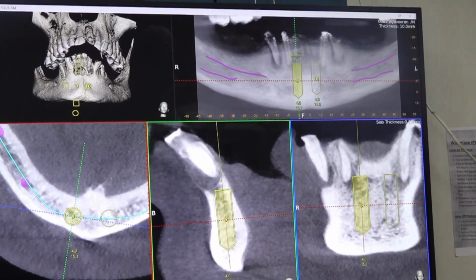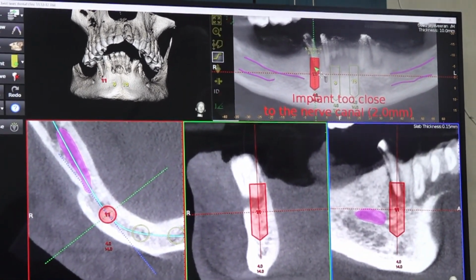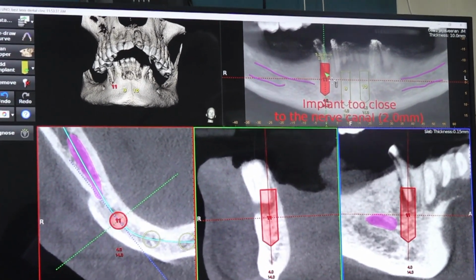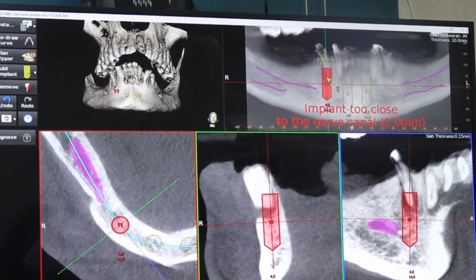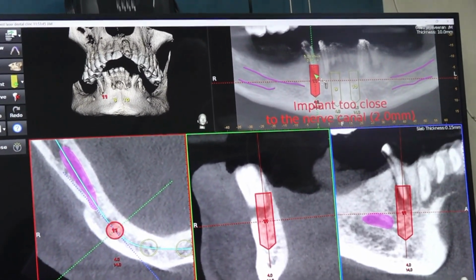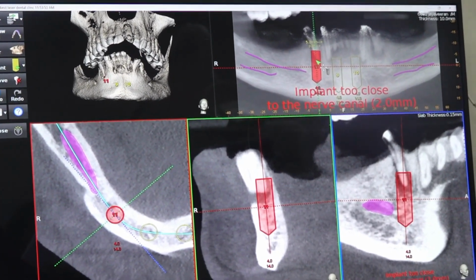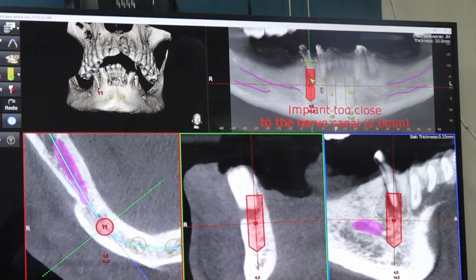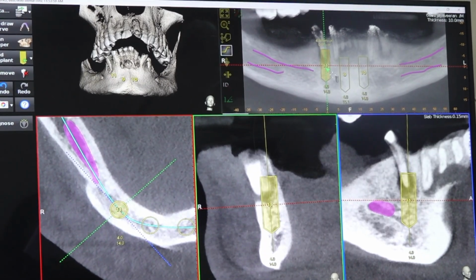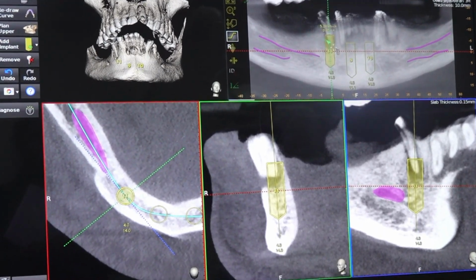Now we are going to the premolar implant. If you put the premolar implant straight, then there will be a lot of cantilevering because you have planned not to place a distal implant. So definitely it is better to use a screw retained implant. We will be using a screw retained single piece implant and we will give a titanium bar with cantilever. So if you place the implant straight in the first molar region, first premolar region, there will be a lot of cantilever.